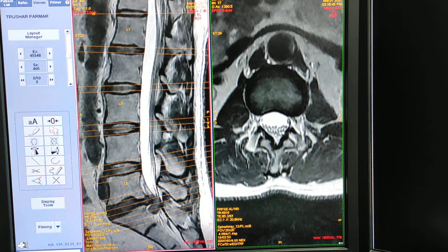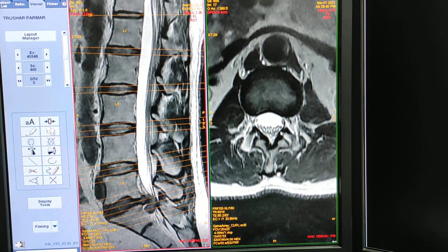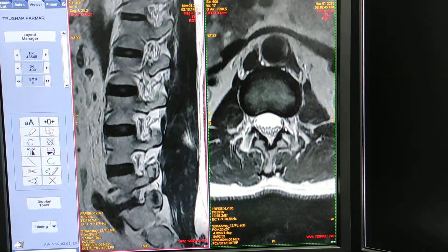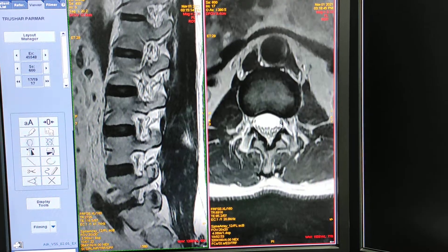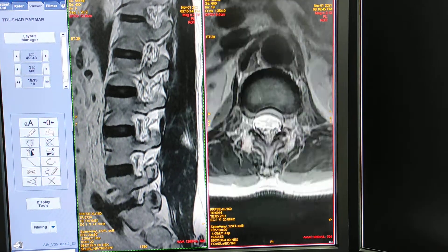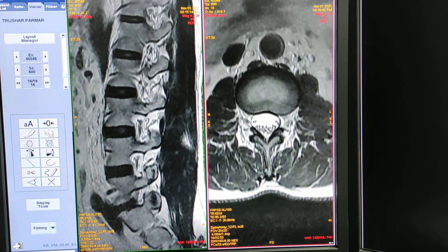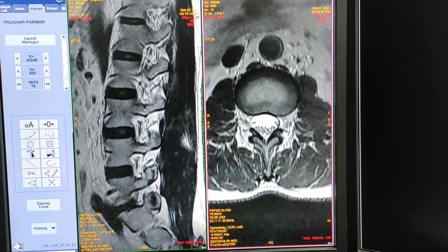These small dots are all nerve roots. This is the exiting nerve root, this is the traversing nerve root, and this is the exiting nerve root.